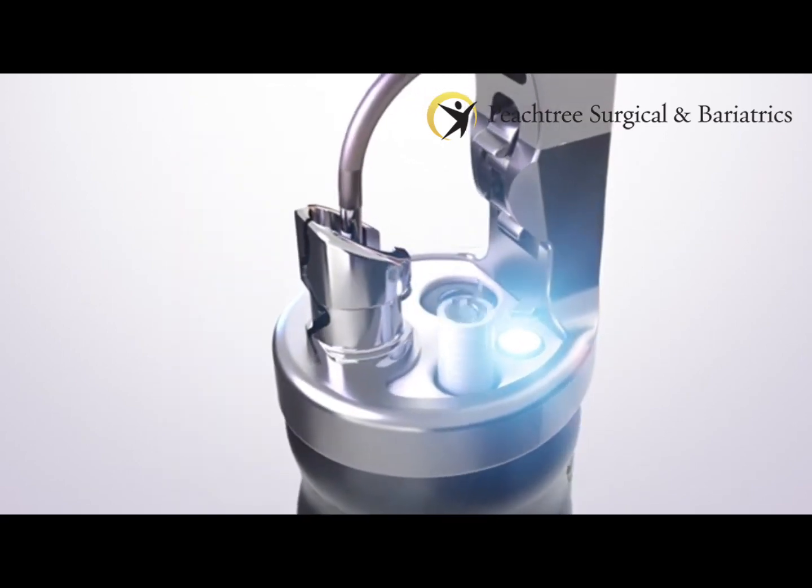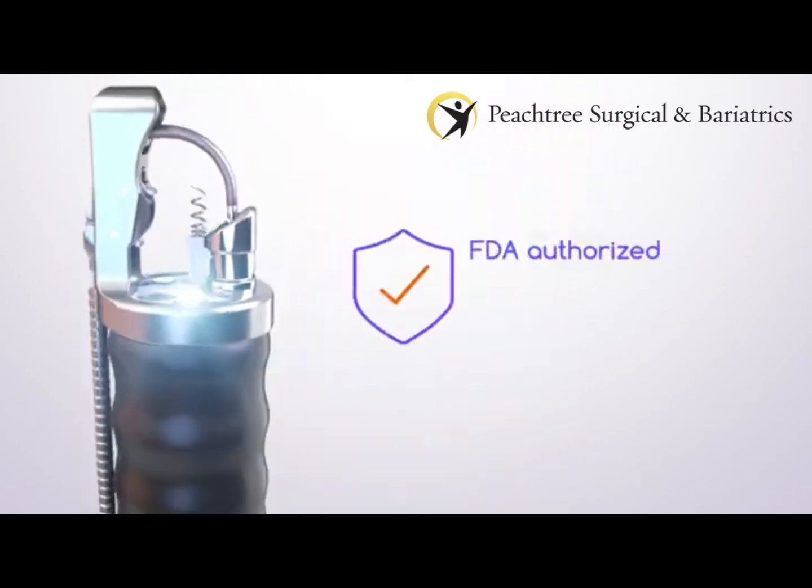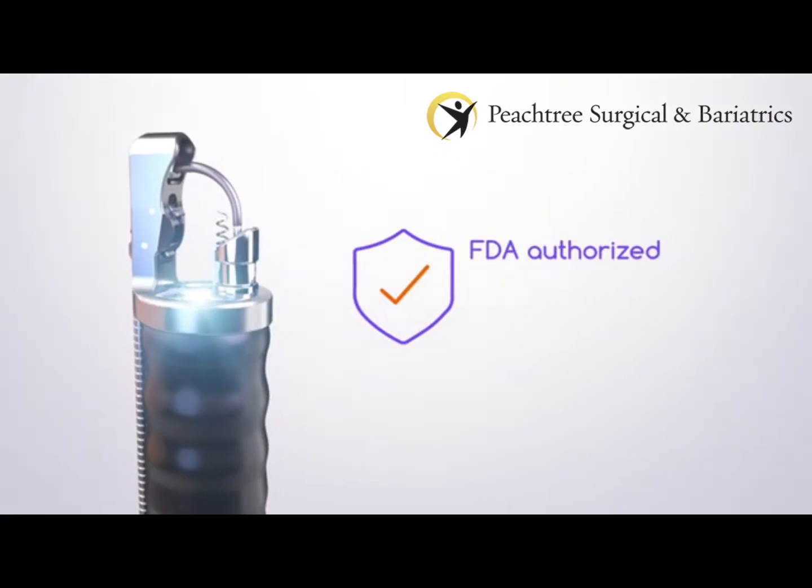Sutures are applied using the Apollo Revised System, the first and only system authorized by the FDA to perform this endoscopic revision after gastric bypass. It is indicated in adult patients with obesity who have a BMI of 30 to 50.